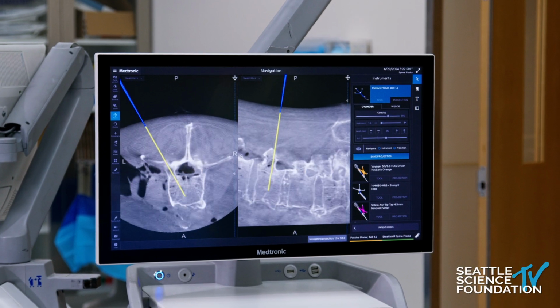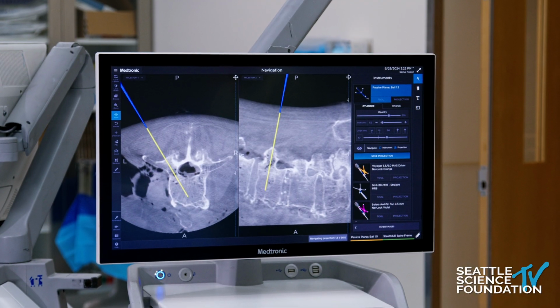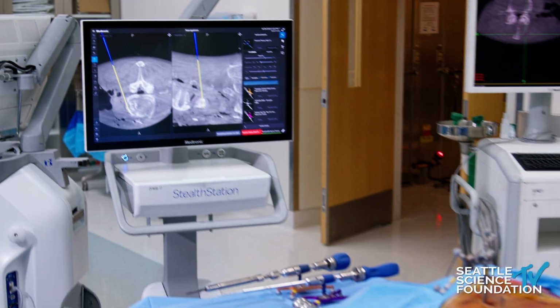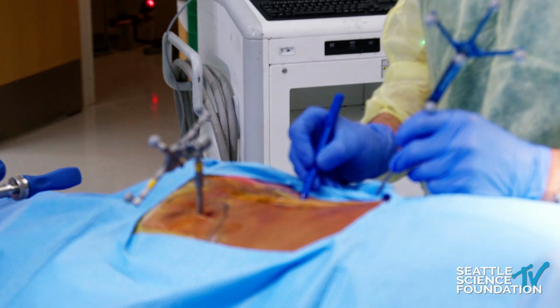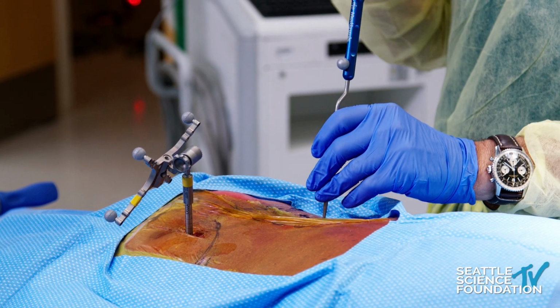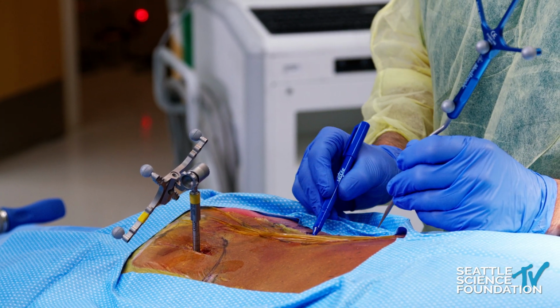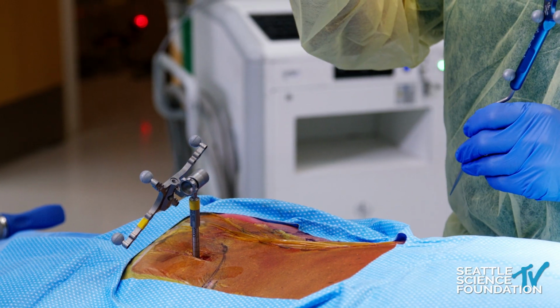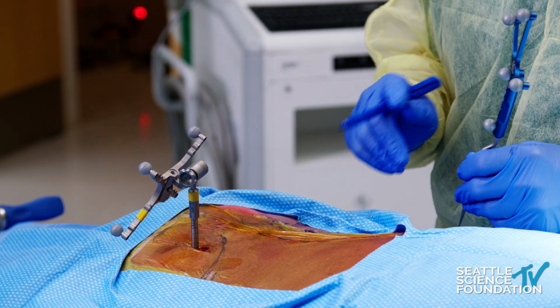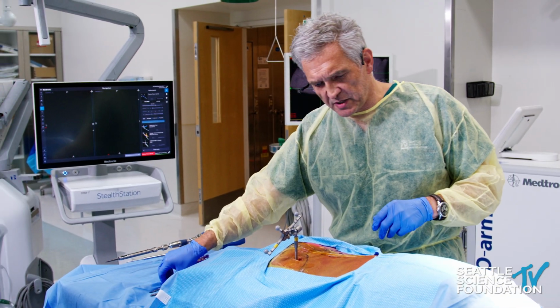I go to L3. Let's say we do L3, L4 in this case. I mark the same trajectory for L3 on the skin. And then I either make 2 skin incisions, or I make one skin incision. I connect the 2 skin incisions. If this is the side where I'm going to drop the tube for the facetectomy, I would mark the skin incision a little bit more medial, because I'm going to make a second fascial skin incision a little bit more medial to drop the tube. If this is the side where we just put in the screws, I'll just connect the dots and make the skin incision. So we're going to do that now here.